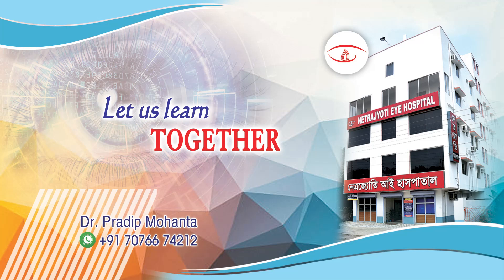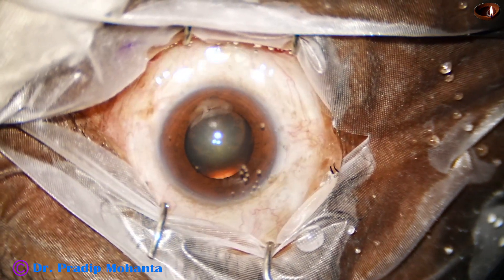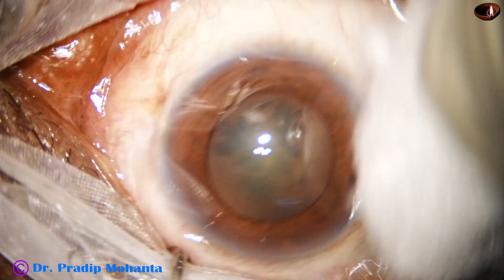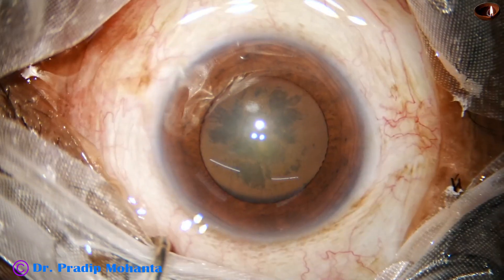Friends, welcome to my workplace at Ranaghat, West Bengal, India. Let us observe this totally unedited surgery. This is a soft cataract. The ocular surface is thoroughly irrigated with BSS, instilling a few drops of povidone iodine.